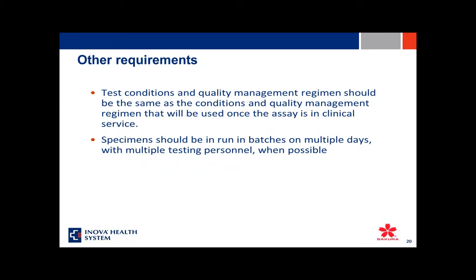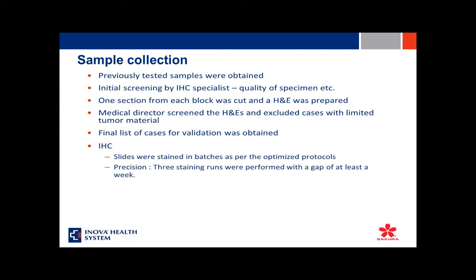And as always, your test conditions and your QC regimen should be the same as the conditions and the quality management that will be used once you have your assay in clinical service. And again, specimens should be run on multiple days with multiple testing personnel whenever possible.